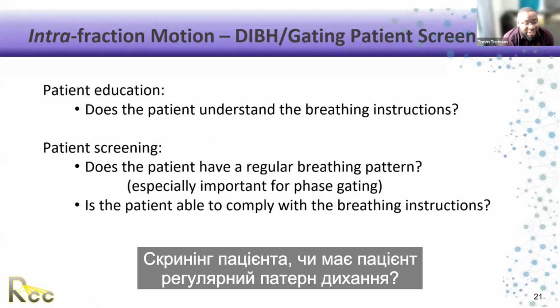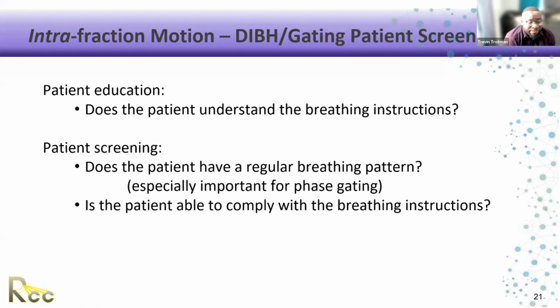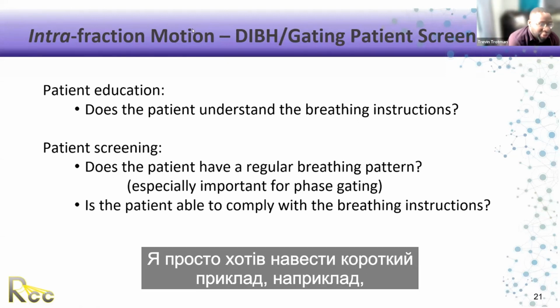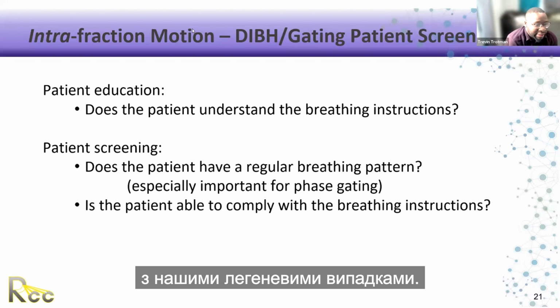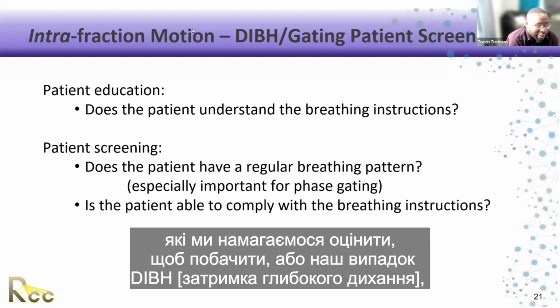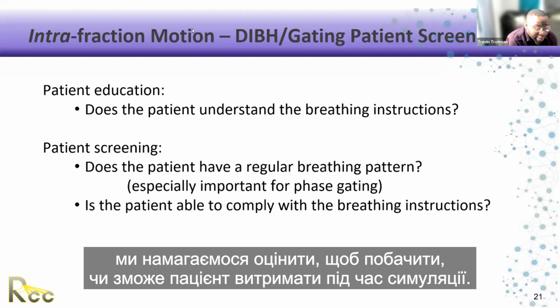Patient screening, does the patient have a regular breathing pattern? Sorry, no problem. Patient screening is a big thing. I just wanted a quick example for our lung cases, or our DIBH cases: we try to assess to see if the patient can tolerate the time of the SIM. So we try to prep ahead.